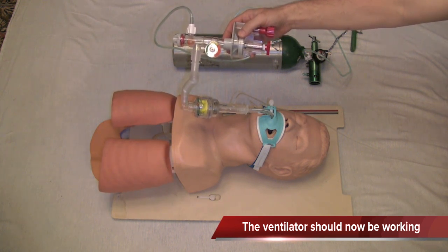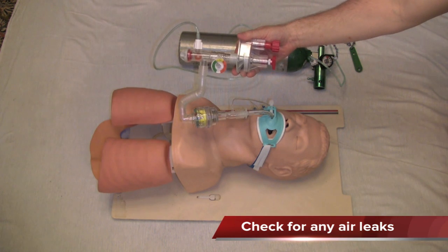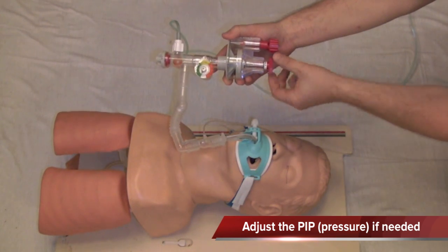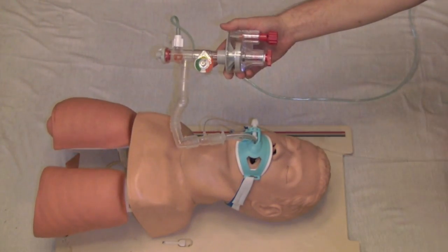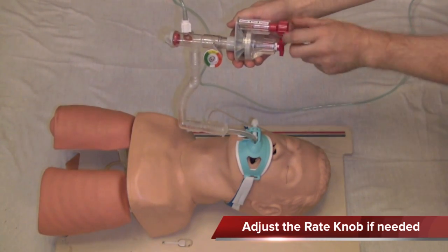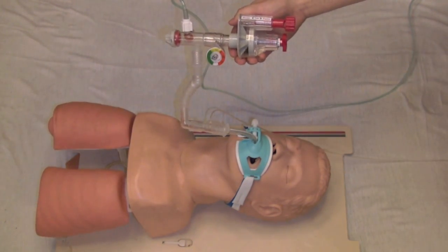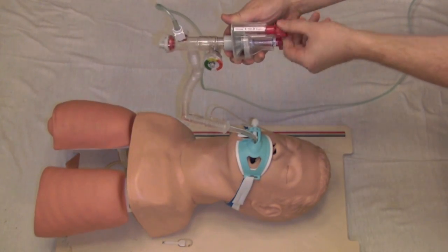As you see, the patient will have chest rise, and here we can clearly see the lungs, and the manometer will be going up. At this point, you want to check for any air leaks in the system and adjust the pressure with the PIP valve. The preset 25 centimeters should be adequate, but you may need to go higher. Here we're looking for chest rise. If you're checking for the position of your advanced airway device, you may want to have the patient breathe faster so that you can check lung and epigastric sounds.